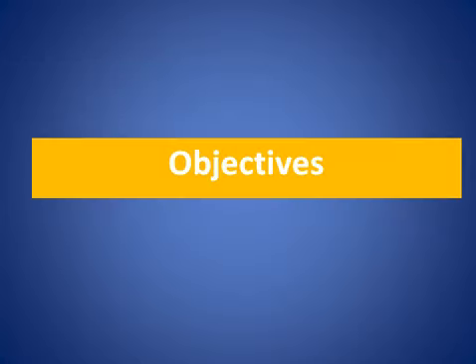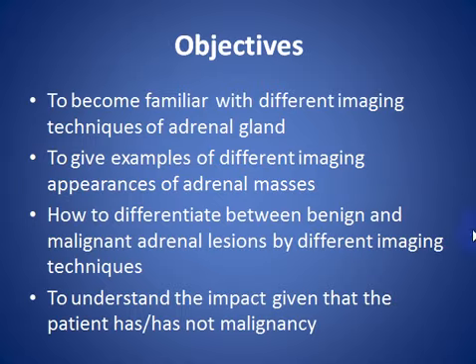My objectives: to become familiar with the different imaging techniques of adrenal gland, to give examples of different imaging appearances of adrenal masses, how to differentiate between benign and malignant adrenal lesions by different imaging techniques, to understand the impact given that the patient has or has not malignancy.